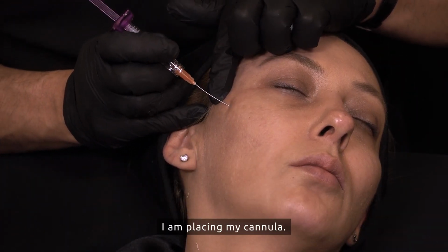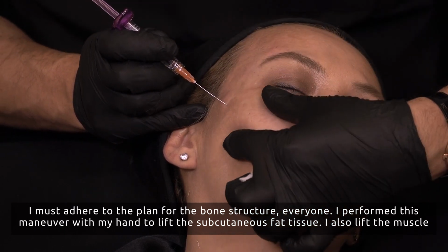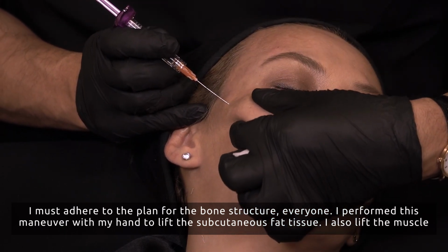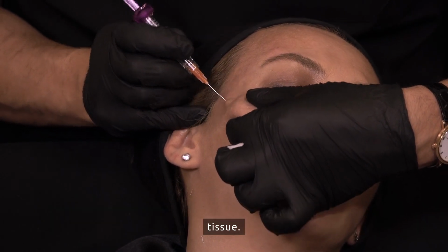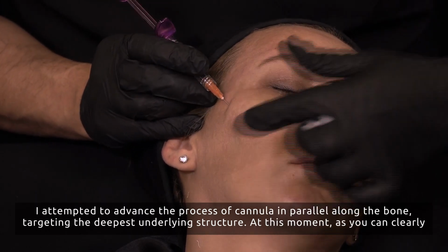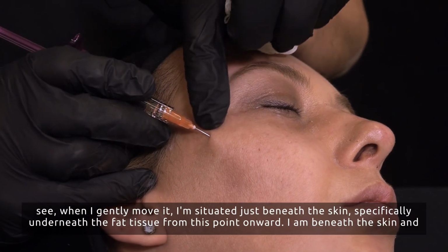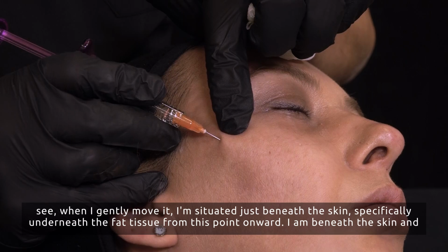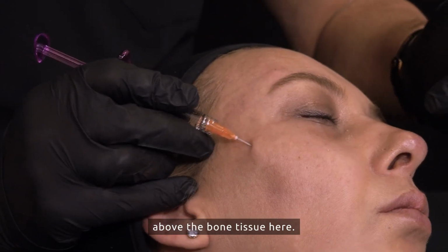I am placing my cannula. I must adhere to the plan for the bone structure, everyone. I perform this maneuver with my hand to lift the subcutaneous fat tissue. I also lift the muscle tissue. I advance the cannula in parallel along the bone, targeting the deepest underlying structure. At this moment, as you can clearly see, when I gently move it, I'm situated just beneath the skin, specifically underneath the fat tissue from this point onward. I am beneath the skin and above the bone tissue here.